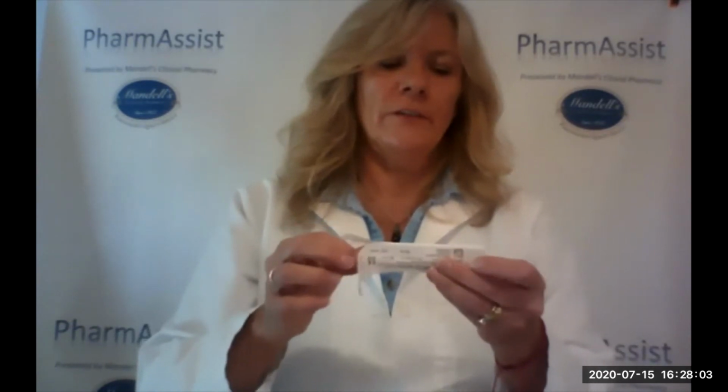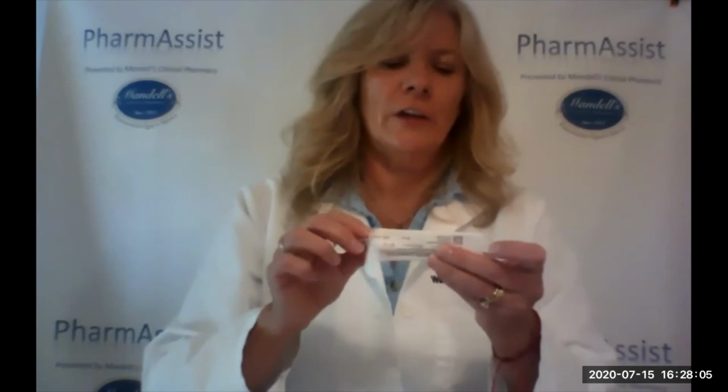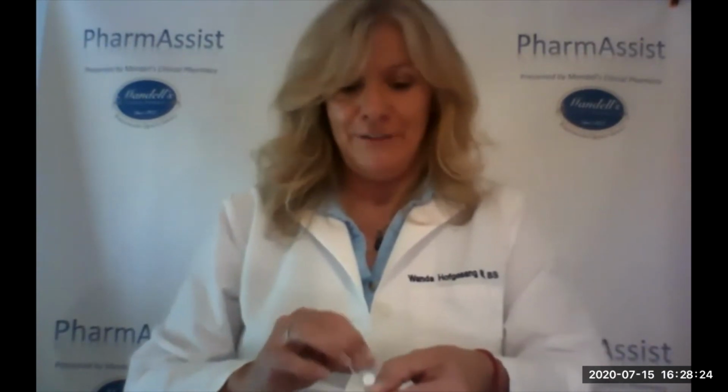And with live TV, I've just actually bent the needle a little bit, so I'm going to put that down. See, even for me, things like that happen. And that's perfectly okay. I could feel myself bending that needle because it's very fine. So if that ever happens, I'm going to put that in the sharps container, but let me try again. See, it doesn't matter. Even you can have that happen, but even I can have it happen, so don't worry. So I'm taking out a brand new needle and syringe.